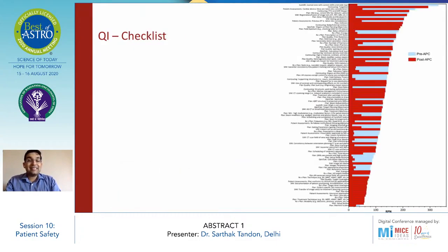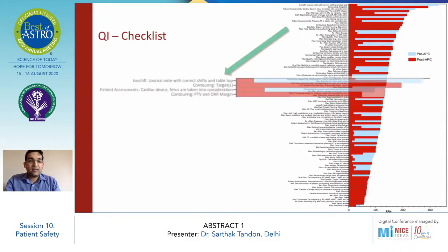So this is the checklist, this exhaustive checklist. In fact, it consisted of about 101 check items in total, and it was Pareto sorted by RPN. They wanted to identify the automation priority, and so far they had automated about 60% of these 101 check items.